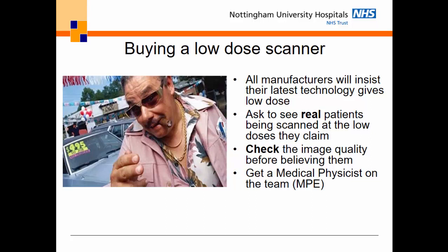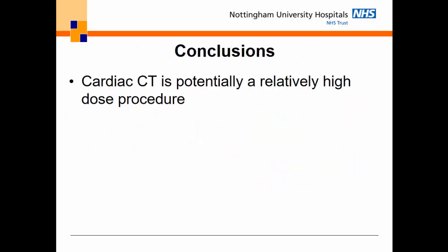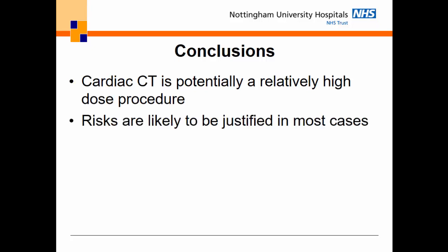I would suggest you get a medical physicist on the team. I'll probably go through about 4 procurements every year for buying a scanner. Most of you will probably buy 1 scanner in your careers. So get some expert help. It really does help. So in conclusion, cardiac CT is a relatively high dose procedure.